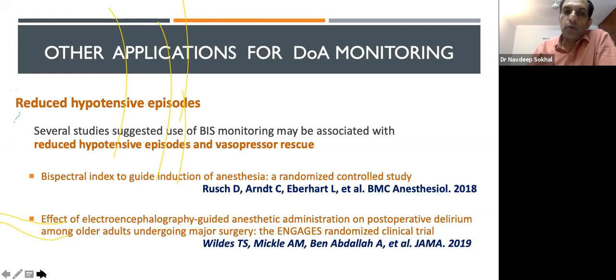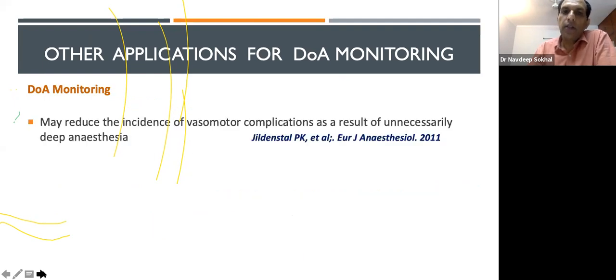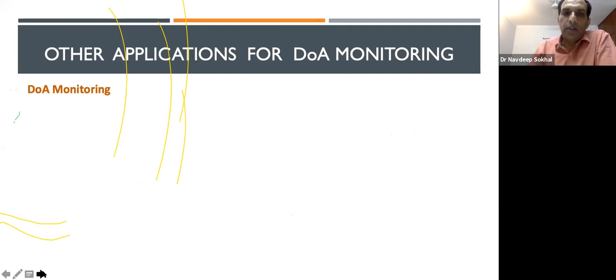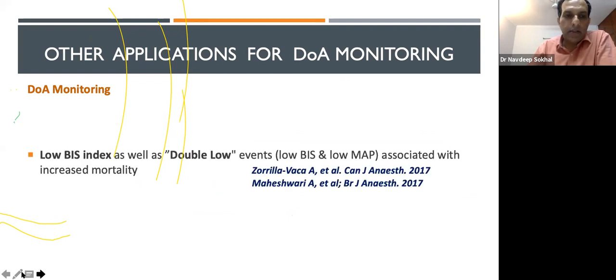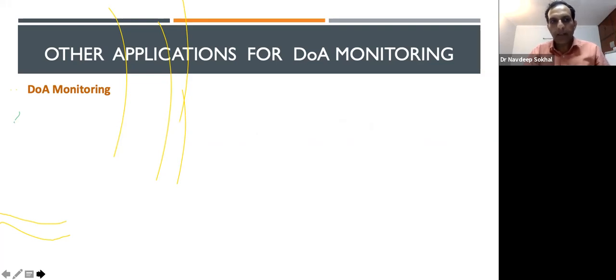Another important issue is reduced hypotensive episodes. Several studies have shown that using these monitors reduces hypotensive episodes as well as vasopressor use in the intraoperative period, so that is a beneficial effect we can have. It may reduce the incidence of vasomotor complications as a result of unnecessarily deep anesthesia. That is one advantage which has been proven in some studies.